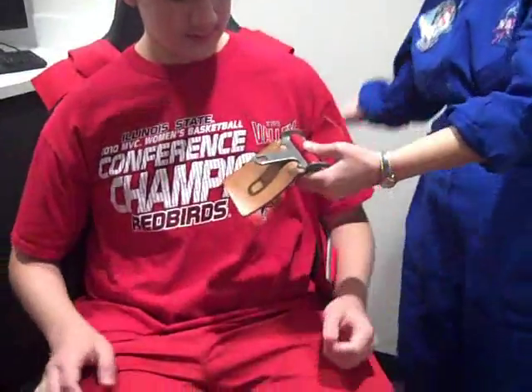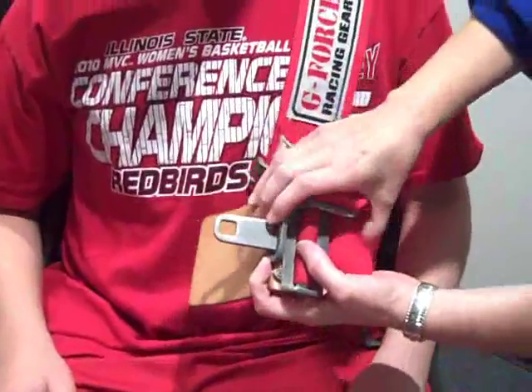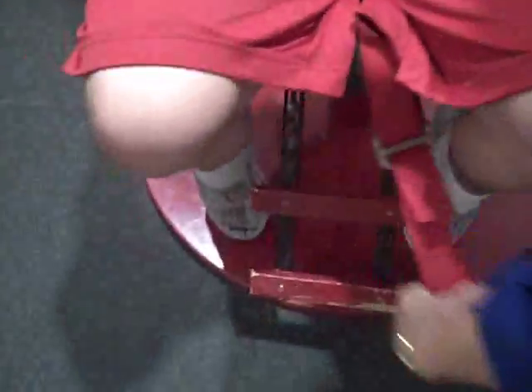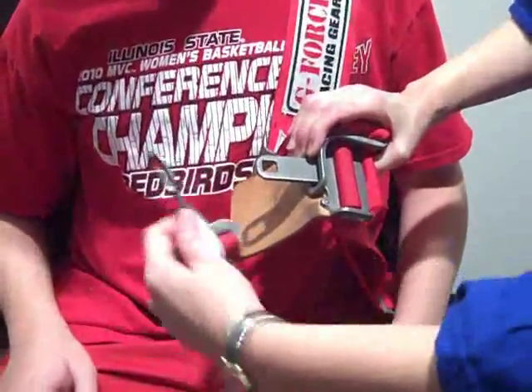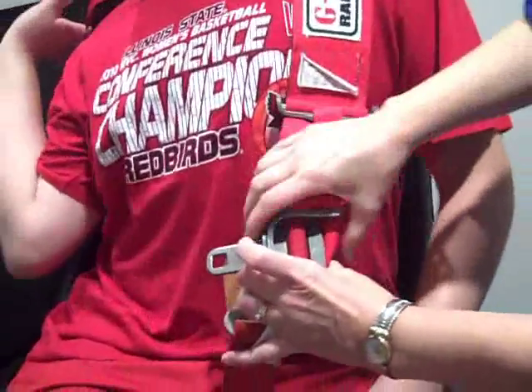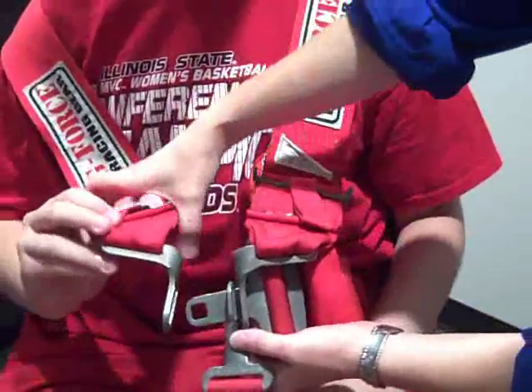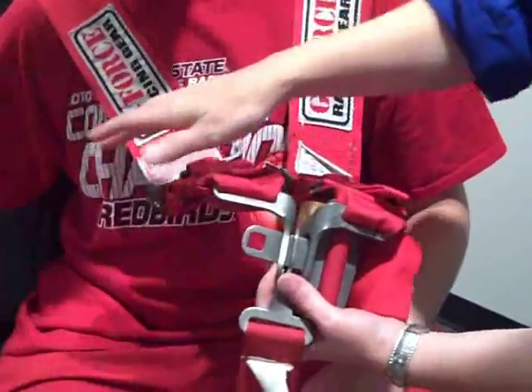Begin by fastening the five-point harness. Take the left lap belt, take the left shoulder, slip it over the tongue. Take the buckle from between the knees, again slip it over the tongue. Then the right shoulder comes across, right onto the tongue of that buckle.